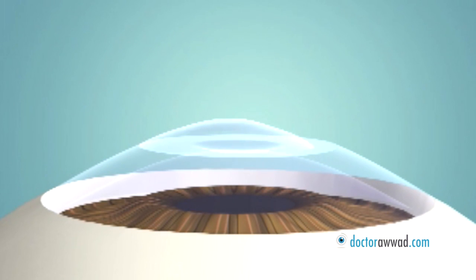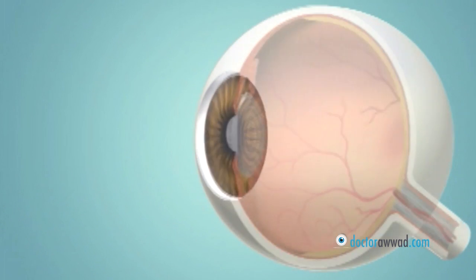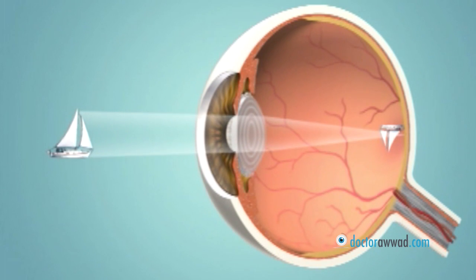The flap is then repositioned back to its place, where it heals by itself. The reshaped cornea allows the light rays to focus more accurately on the retina.